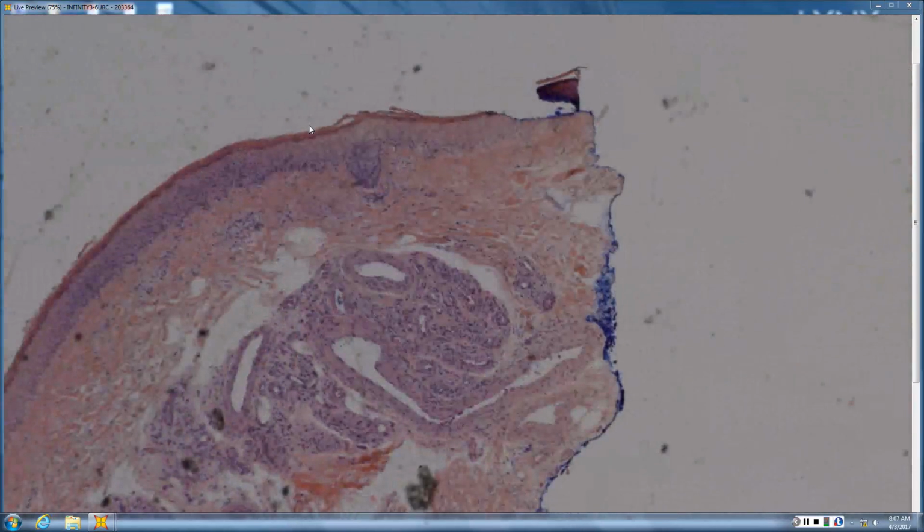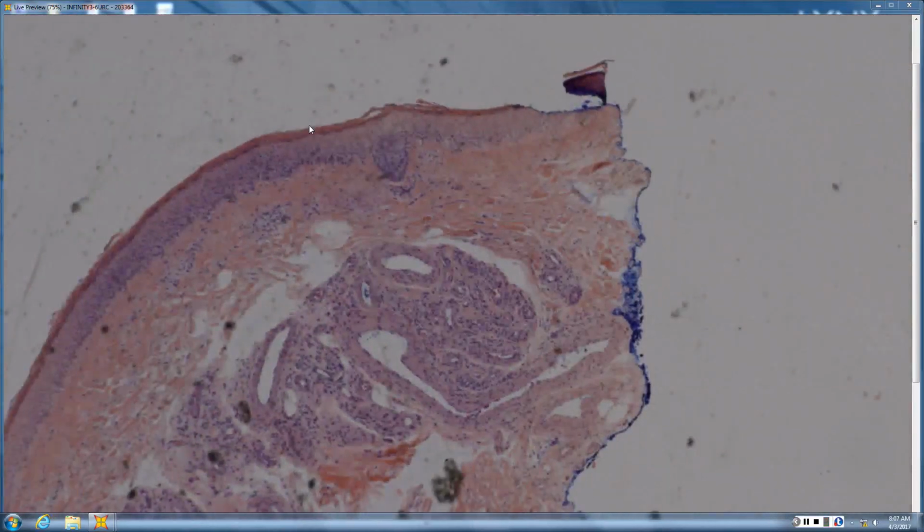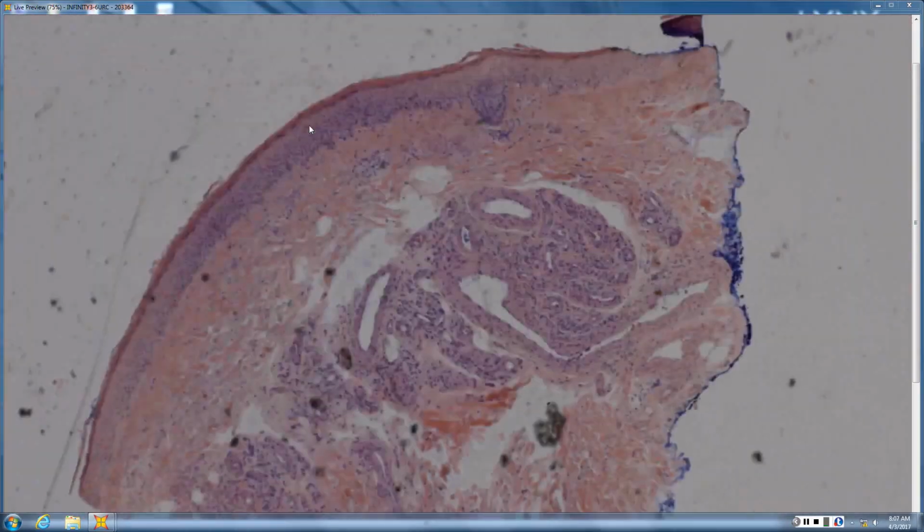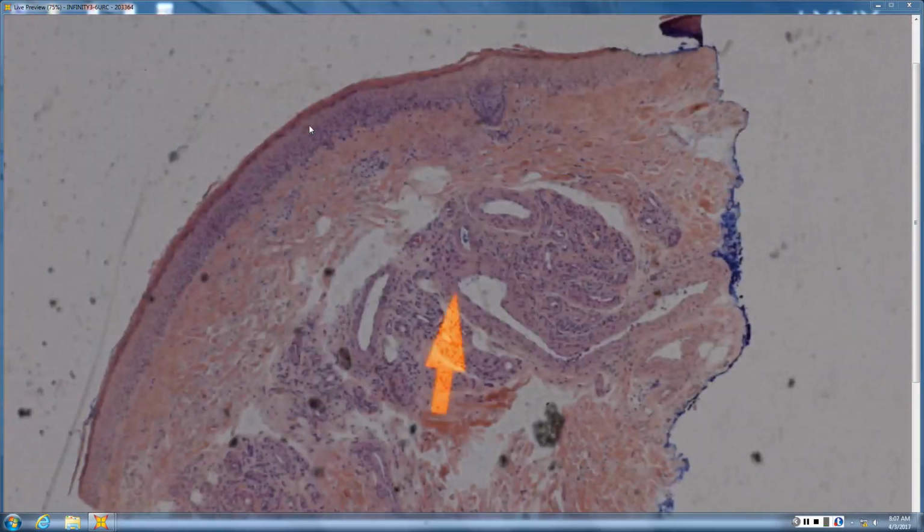So this one has kind of separation and tufting around that area, but what's standing out to me is the big muscular arteries, which makes me think more like AVM. Yeah, so thick and thin-walled vessels, probably AVM.